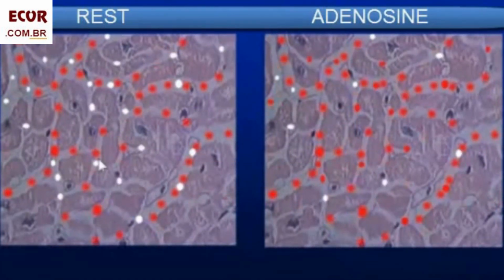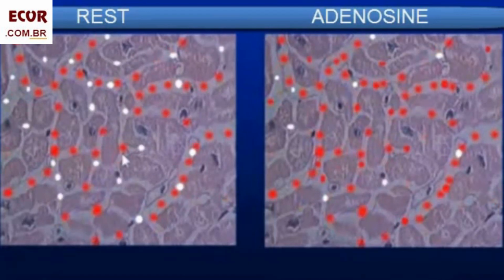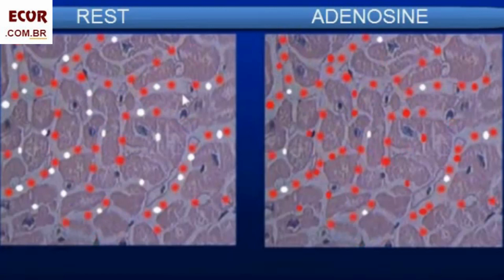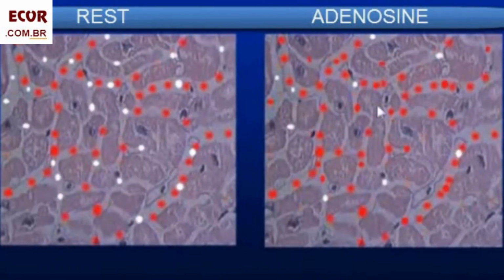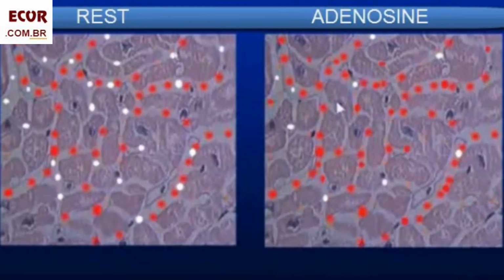And how is ischemia on this exam in case of a viable myocardium? These patients have a perfect microcirculation with no structural lesion. The capillaries are normal, and since the ischemic area is using fully the coronary reserve, all the arterioles of the local microcirculation are dilated already. It has no further capability of dilation. At rest, there is a myocardial perfusion similar at the ischemic and the normal walls. Then microbubbles will come to the ischemic as well as the normal walls.